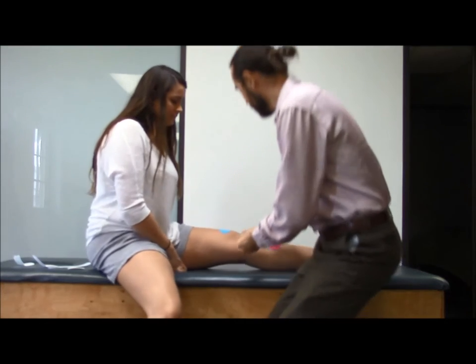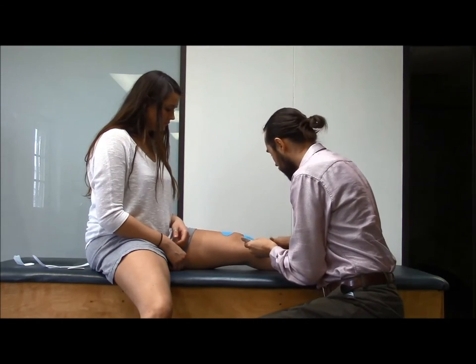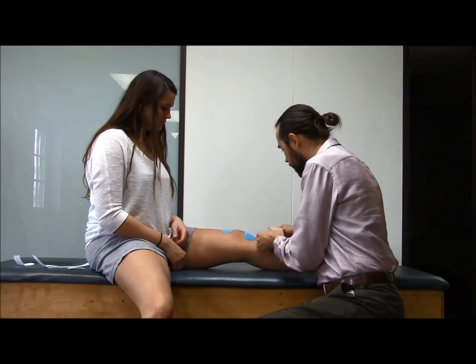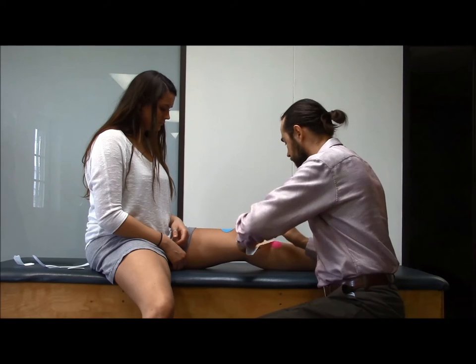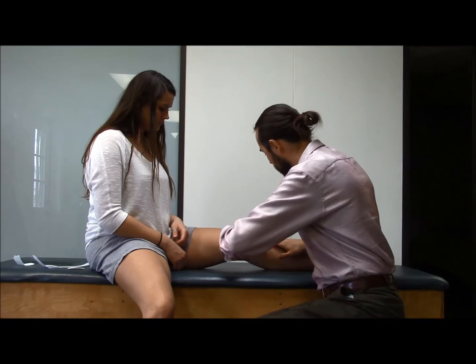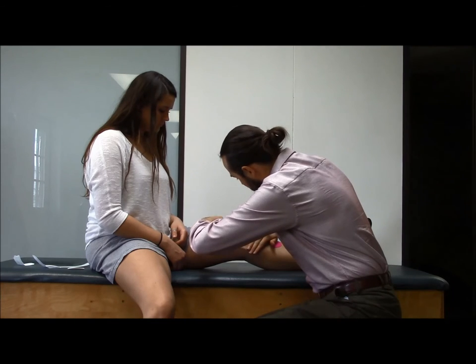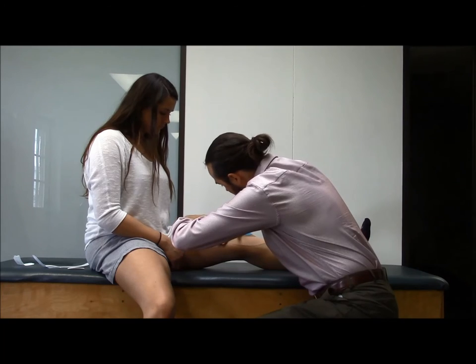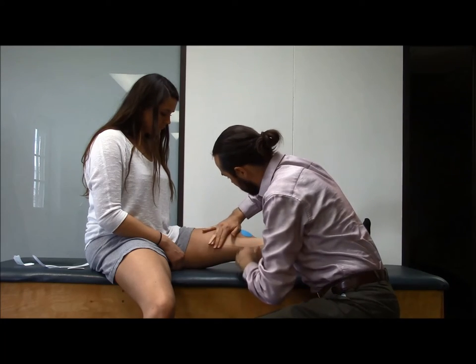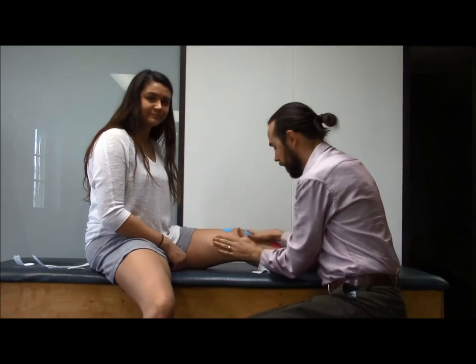So just the opposite then. We'll start here with no tension when you start it. We'll do just a little tension going into the curve so the tape sticks, and then when we get to where that MCL is, we'll do a lot of tension — and that's where you're going to experience the support of the tape. Then just activate it by rubbing it in. The warmth of your hands activates the tape.